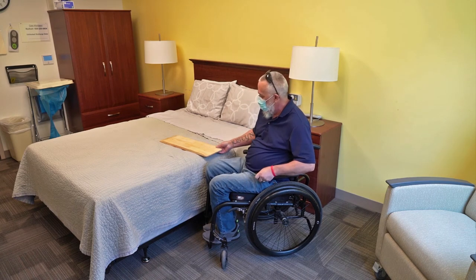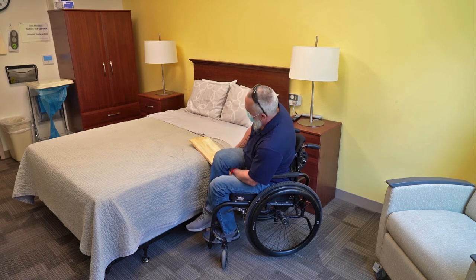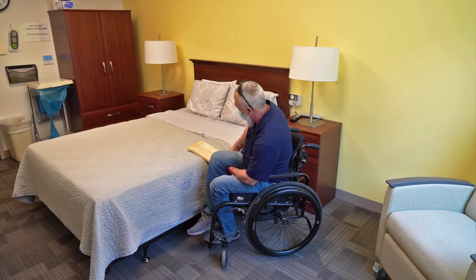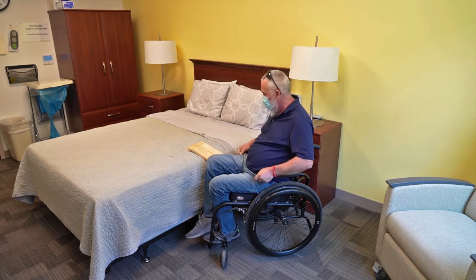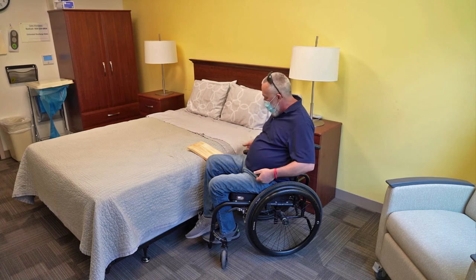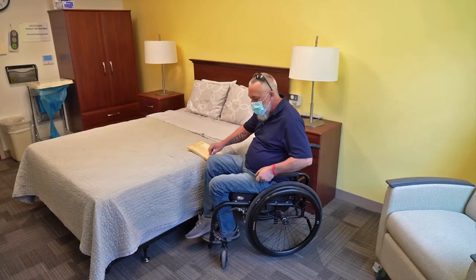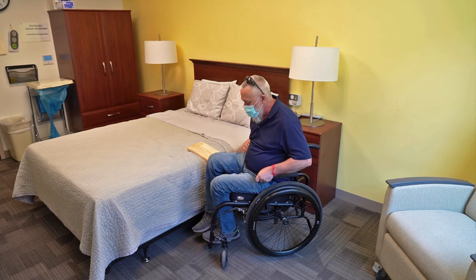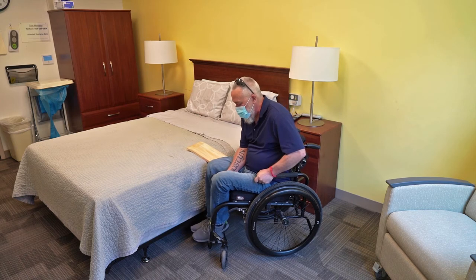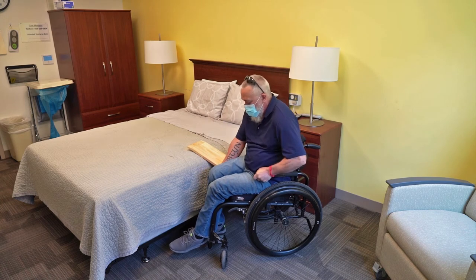So I'm going to take my board and lift up my right leg — the one closest to the bed or whatever you're transferring to. Now I use handles on my wheelchair; a lot of people don't, some don't like them, but I prefer them. They do inhibit the slide though, so I'm going to move this one out of the way. Another important thing is foot position — when you're sliding, if your feet aren't in the right position they'll tangle up, and that will cause a problem with the slide.